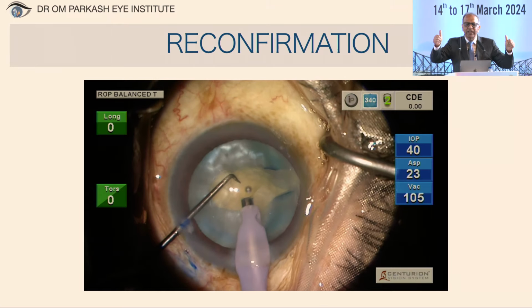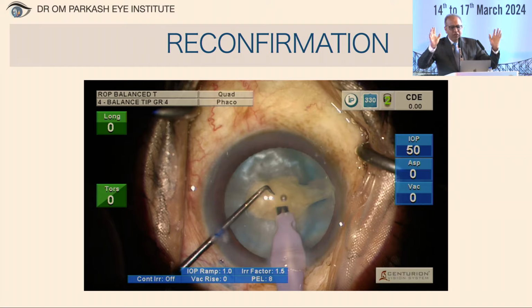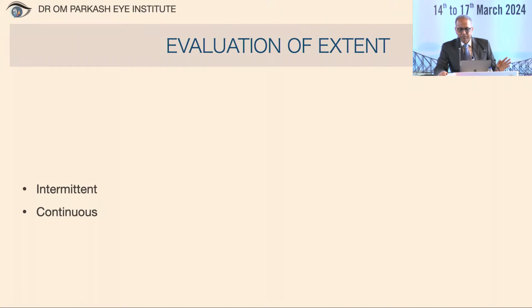So the first thing, we know it is pre-equatorial. Now what next? The next part is we have to evaluate the extent of these tears. How do we evaluate? You can do it intermittently, or what we have done in our scenario is, your assistants are trained for it, or somebody who is viewing it, just to see whether the flap is fluttering or not.